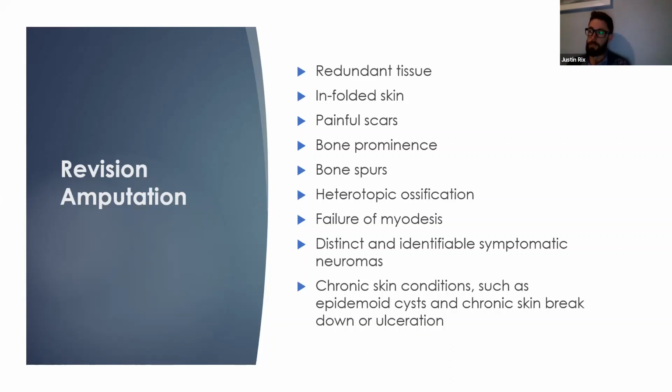which he then agreed to. Within a few weeks, he was finally walking comfortably, pain-free, and his whole mental outlook on prosthetics changed, and towards his work. He was able to walk much longer and much further. And yes, we lost a functional knee joint, however, we gained socket comfort and his ability to ambulate without worrying about the constant skin breakdown. So again, this works to our favor.